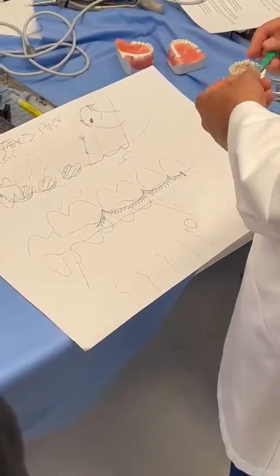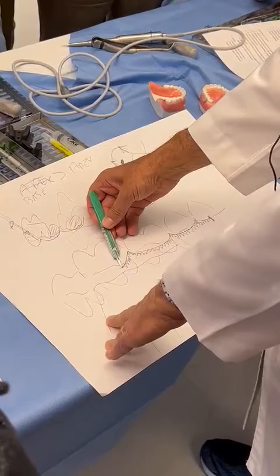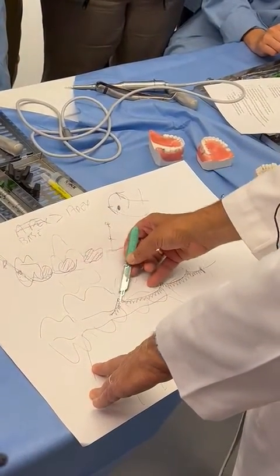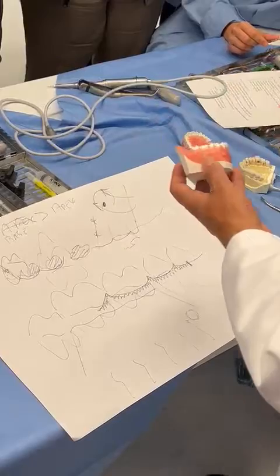So here's the trick to a full thickness mucoperiosteal flap. Take your blade, and what you do is once you touch bone, you touch bone with the blade, you push. You can try on this type of... Doctor, it's for perio. Yeah, you can use the perio one. Sure, we have these.